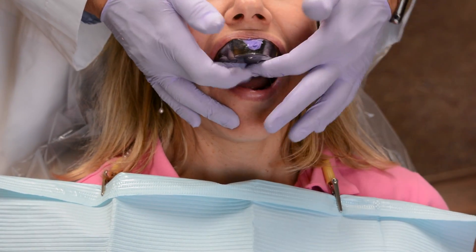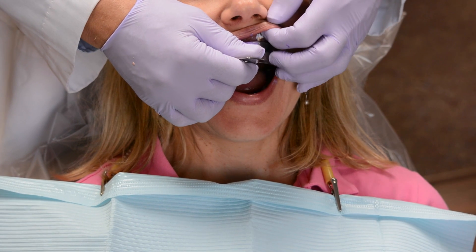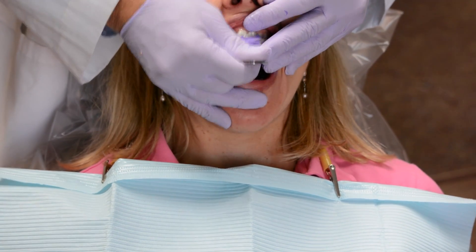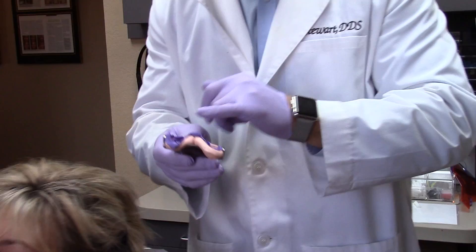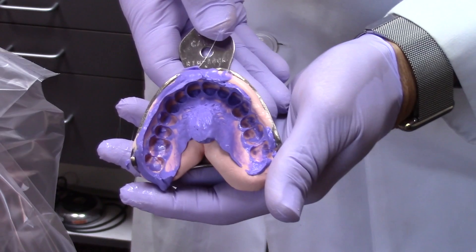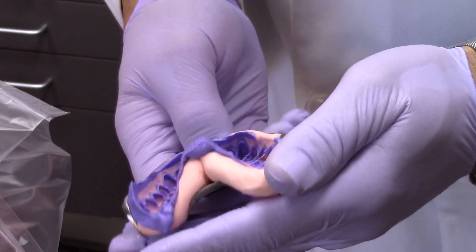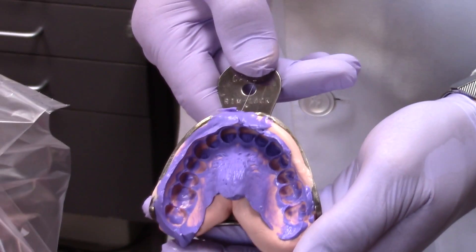It's been sitting for four minutes now and it's ready to pull. I ask the patient to pull their head backwards up towards me, and I pull down and we get a nice final impression. If you look here, you can see how the gingival margins are very accurate, very crisp, and very clean. We'll go pour this up and then you can see how that translates into the model work.